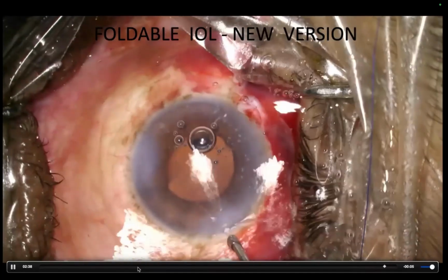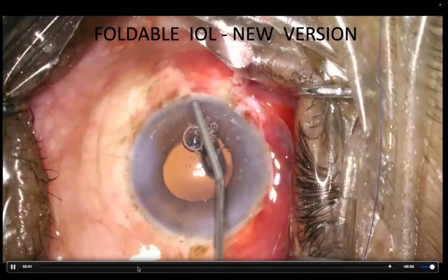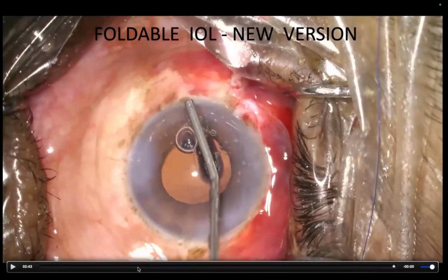So when do I do this procedure? When the conjunctiva tenons is very fibrous. So if it is a paying patient and the patient wants a foldable intraocular lens, a better lens, we use this technique. And last week also we had a case where a temporal clear corneal incision was done elsewhere. The cornea was very bad temporally, and a superior sclerocorneal tunnel also was done. It was pretty bad. So what we did is we went to the opposite side. It was a right eye, so we sat on the left side, made a nasal incision, and very comfortably we could do it. Though it was a deep socket, it was very easy. You can make incisions on whichever side and do it.